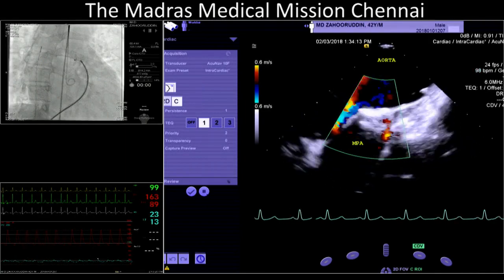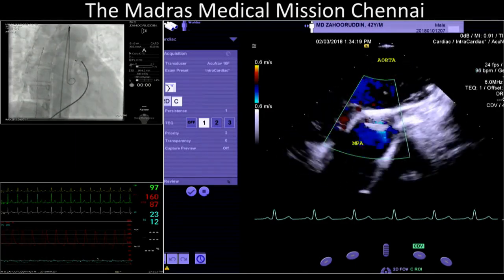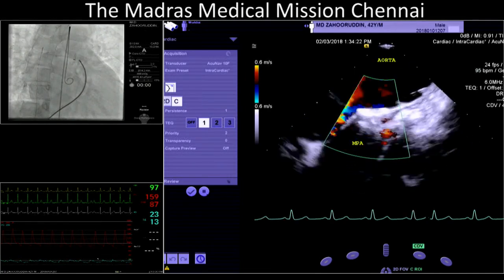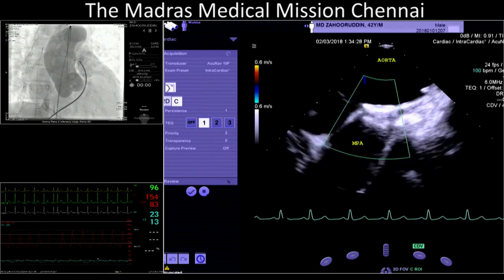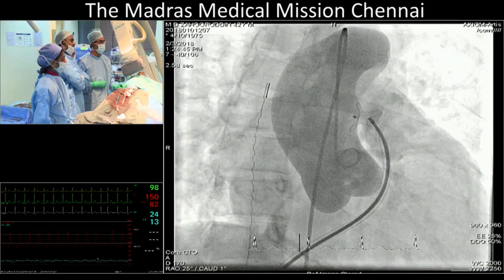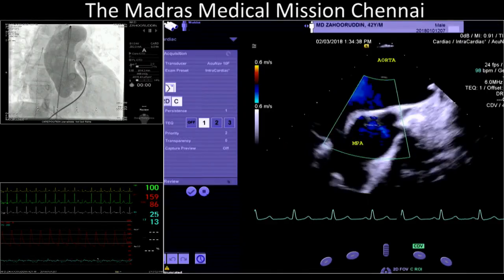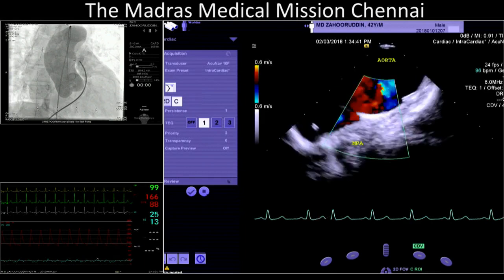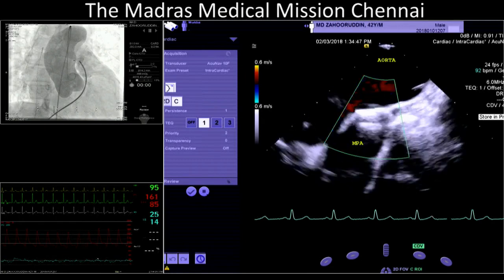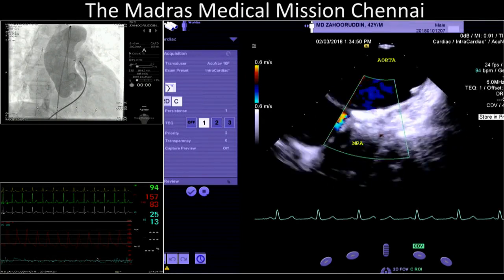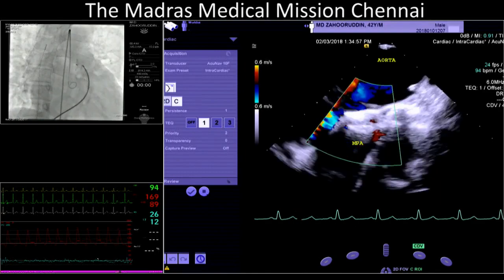That is a wonderful position. Intracardiac echo is better — show the intracardiac echo. It looks like a closed pot shunt but on the vessel walls inside. Dietmar, if you're happy, I'm going to release. Release. I trust in you — I've become your fan more and more.